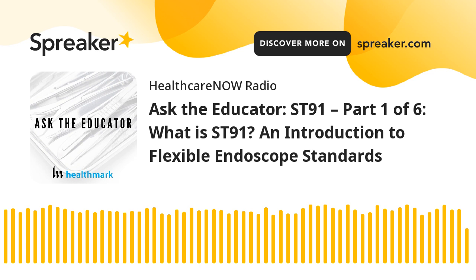So these are covering topics like contaminated transport in the endoscopy world. So getting your dirty scope from the procedure room to wherever it's being reprocessed, that's an OSHA regulation that says you must transport it in this manner, in this type of container. The requirement to have appropriate PPE for employees within a healthcare facility, also governed by OSHA regulations. Having to take bloodborne pathogen training, also covered by OSHA. So again, must meaning those situations that are mandated, you have to do them even above and beyond the standard.